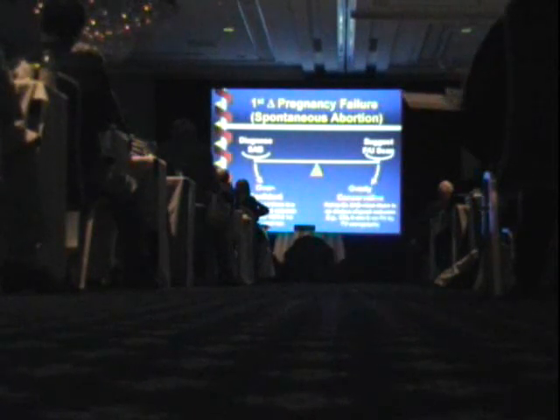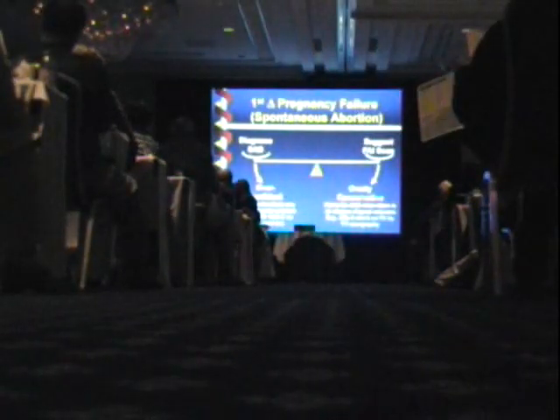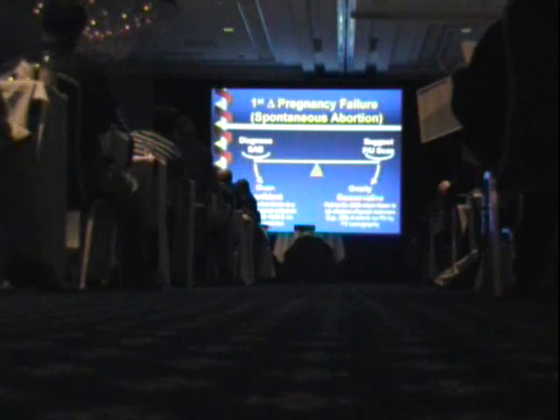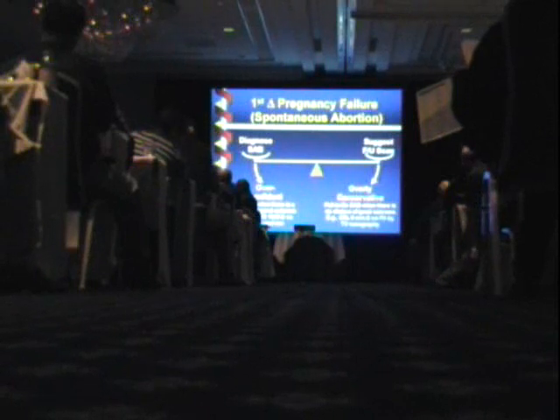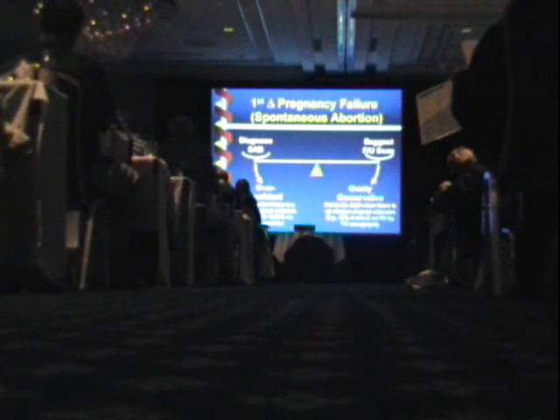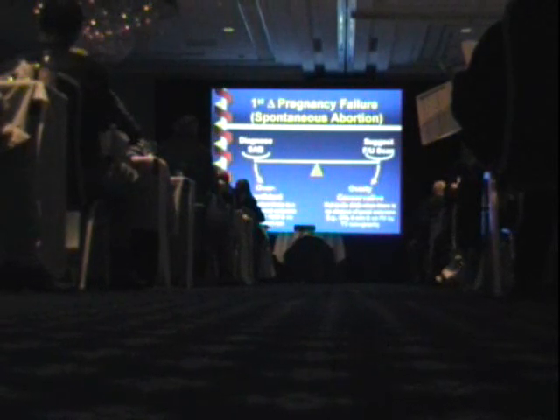You don't want to go too far in the other direction and be overly conservative. In other words, you don't want to fail to diagnose spontaneous abortion when there's an ultrasound finding that indicates there's no chance of a good outcome. For example, if the crown rump length is 6 millimeters on a transvaginal scan and you see no heartbeat, that pregnancy is definitely a failed pregnancy. And you would be doing the patient a disservice if you fail to diagnose a spontaneous abortion with 100% certainty.